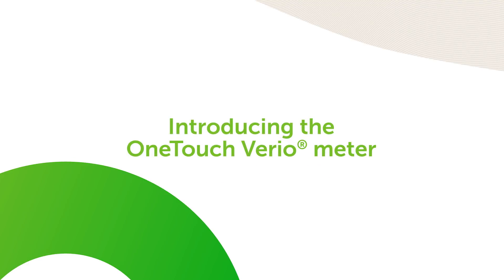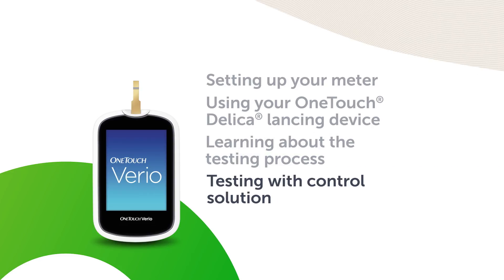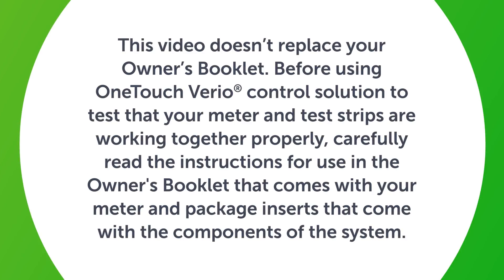Introducing the OneTouch Verio Meter with ColorSure technology. Testing with Control Solution. This video doesn't replace your owner's booklet.